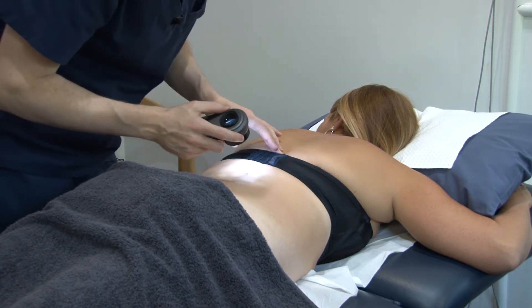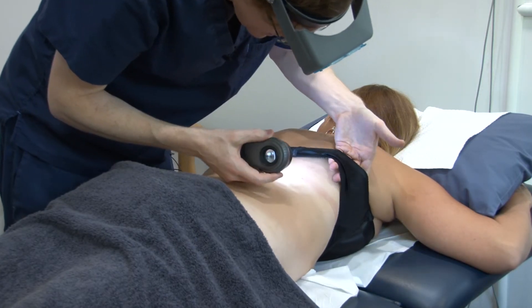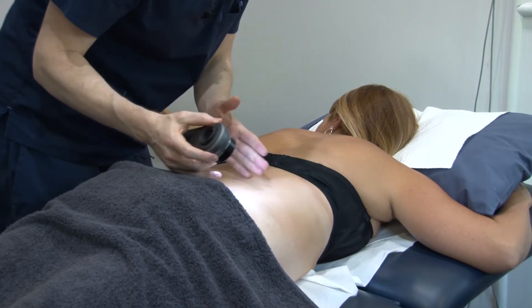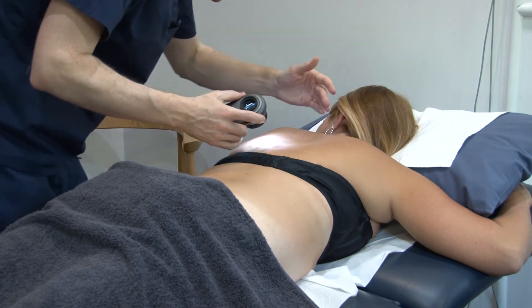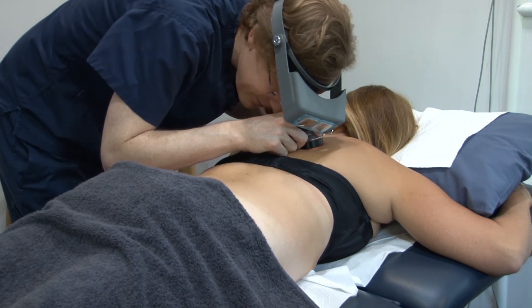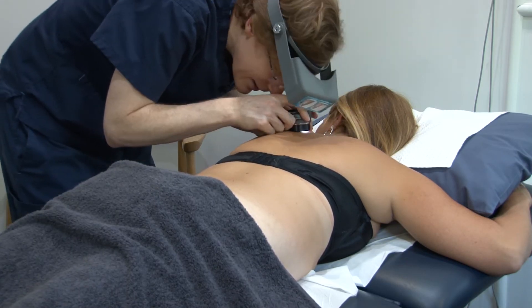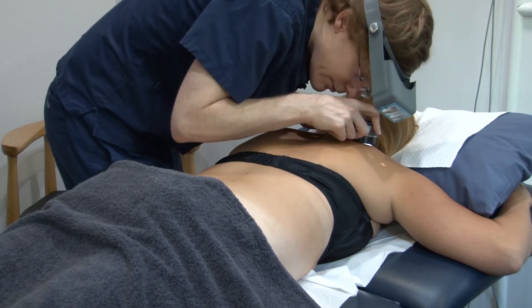Let's have a look under here. Let me stretch the bra a little bit — not actually hiding anything. So bottom and middle thirds done, just leaving the top third of the back now. You do grow the occasional mole with a little bit of extra pigment, but nothing that makes me too nervous. It's all well within the realms of normal.